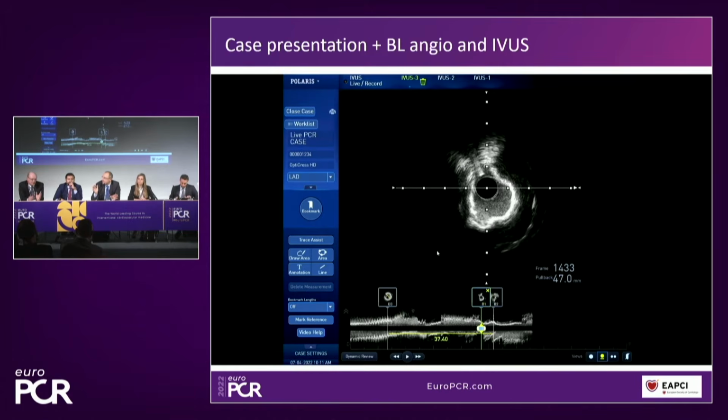Did we forget anything? The other thing I want to do is, now that I've got the imaging, I need to plan where my stents are going to be, particularly relevant to where the main branches are. I don't want to end up with a stent ending either at the ostium of the circumflex or at the ostium of that diagonal. So I need to think about what that segment of disease is, and I need to be visualizing where my stents are going to end, how many stents I'm going to need, how I deal with the fact that perhaps it's going to be 4.5 in the left main, and it may be as small as 3 at the other end. How do I break that up in my mind? How many stents am I going to do?